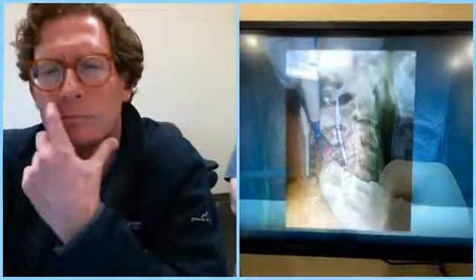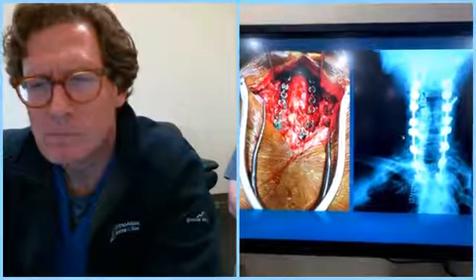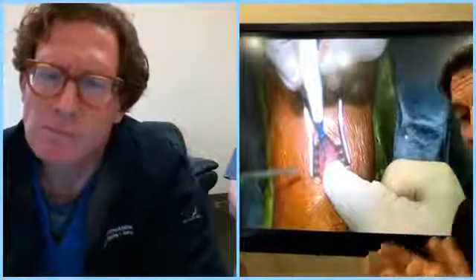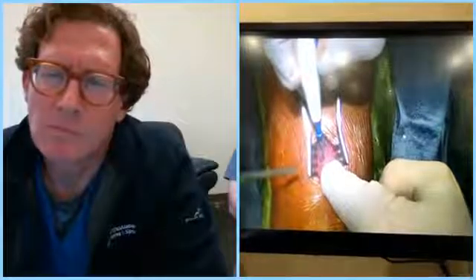And we can deliver a product that looks like this. And this is bones that have been completely reshaped and hollowed out with no screws, no rods, and no fusions. And the reason we didn't have to fuse is because we didn't take out the normal structures that hold the head up. So when we take the cable systems out that hold the head up, we need to rebuild it with screws and rods. If we don't take the cables out, which is facilitated by these new technologies, we can work through tiny holes underneath the important stuff and not have to remove it. And then we can deliver a product that's much more compatible with a normal lifestyle.